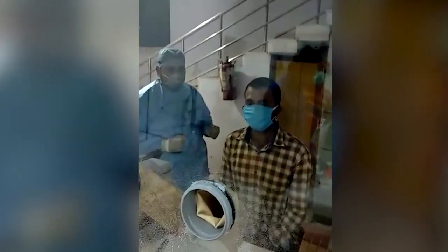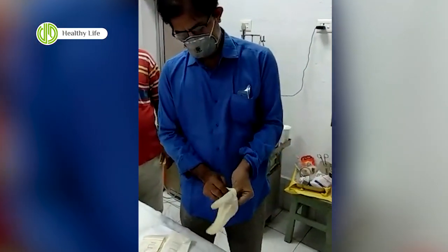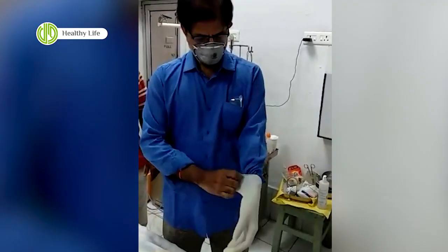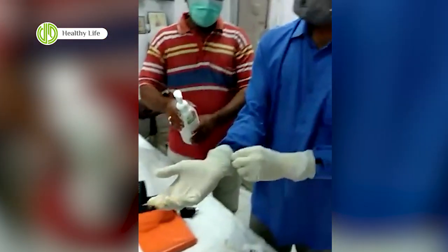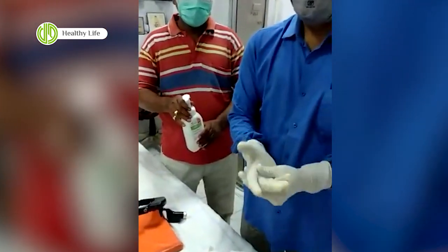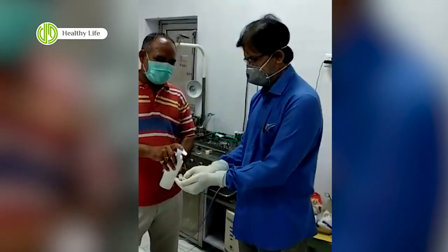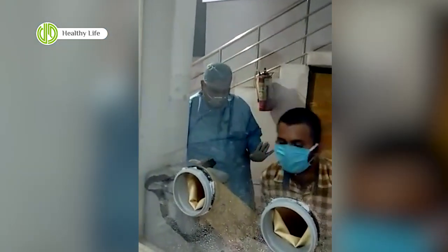This is the second case for which the sampling will be taken by Dr. Ravikant again. The setup is getting ready and almost ready. The hands are sanitized with sanitizer. The patient is also ready, and the area has been sprayed again.